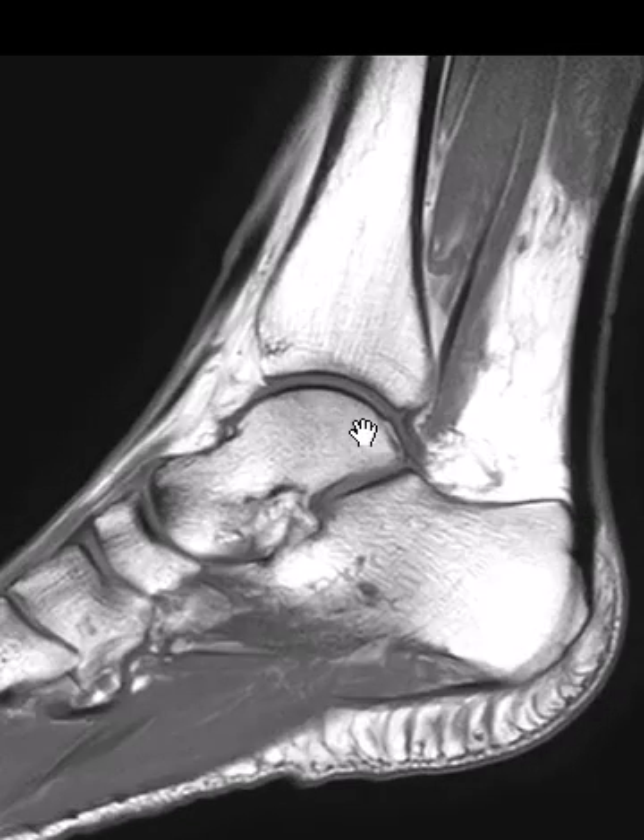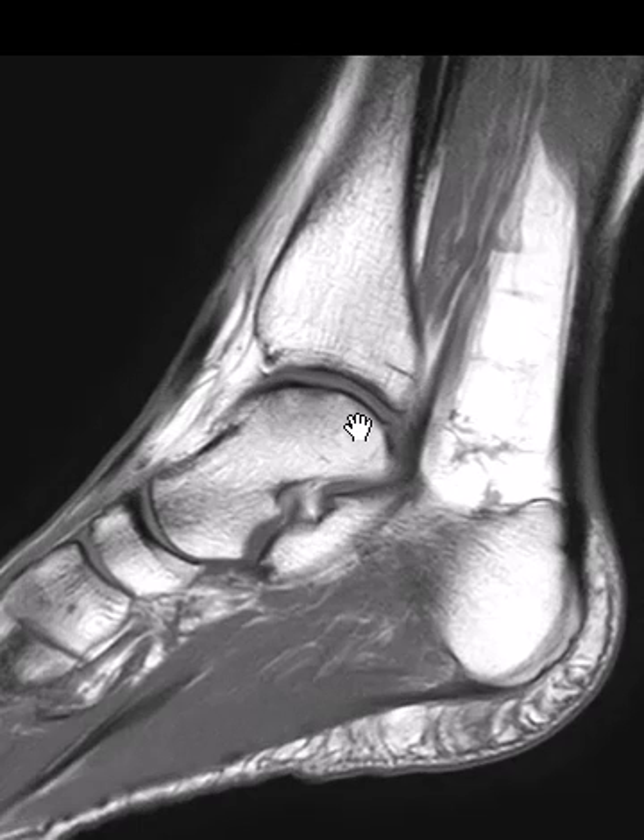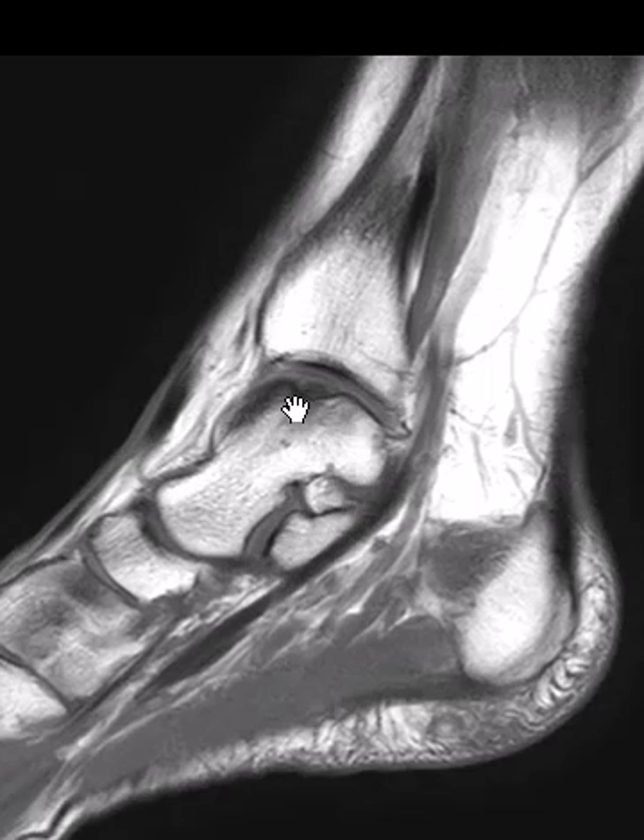So this is the talar dome here, the top of the talus, and along the medial margin over here, we start to see a little subtle deformity. On one more image, we can see this little scalloped area — the medial talar dome. So this is a small osteochondral defect.